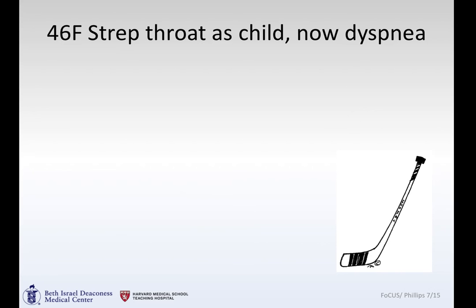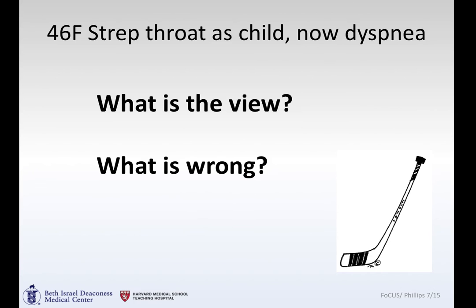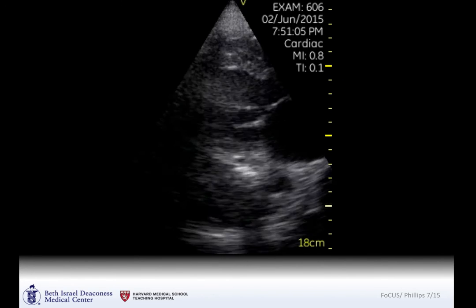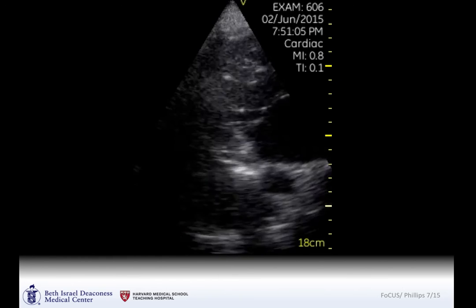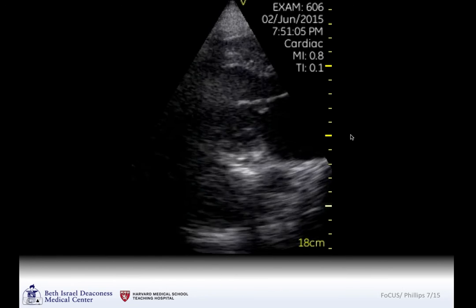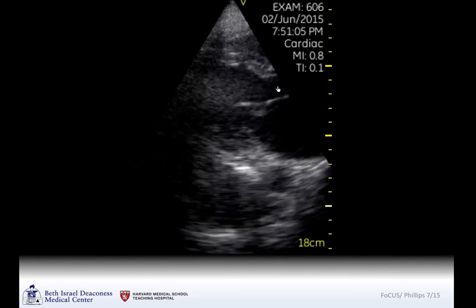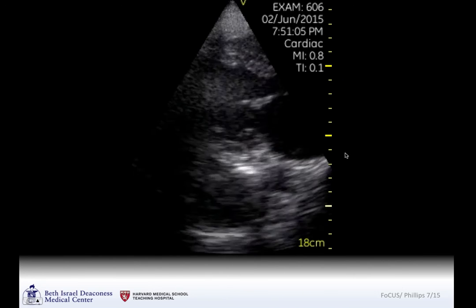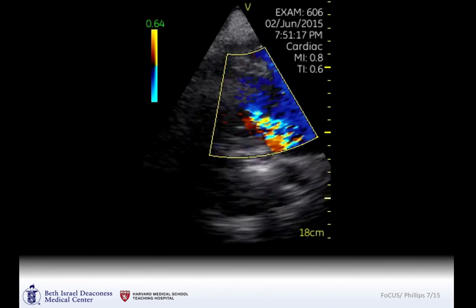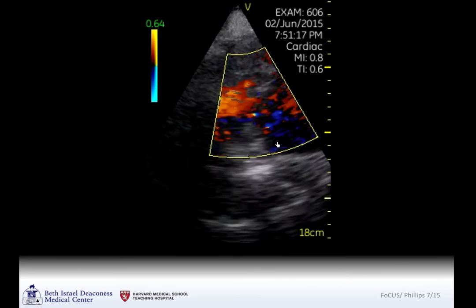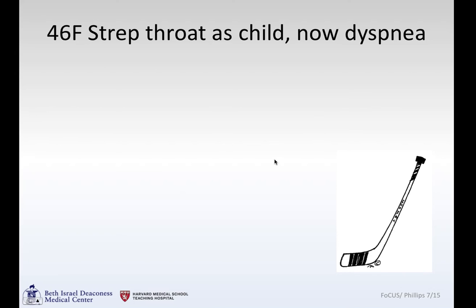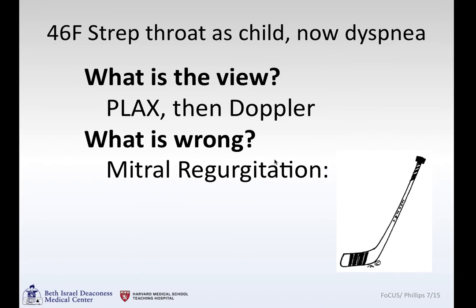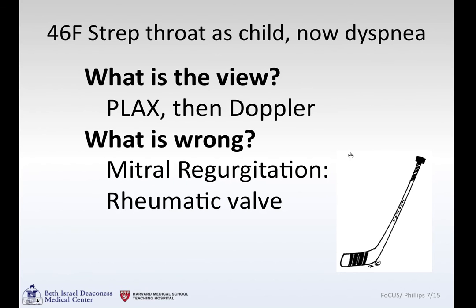A 46-year-old woman with a history of strep throat as a child now presenting with dyspnea. Parasternal long axis view: left atrium, left ventricle — the aortic valve is off the screen. Here's the mitral valve opening; the mitral valve doesn't look totally normal. With a little color Doppler added on top, during systole you can see a regurgitation jet back into the left atrium. Parasternal long axis with Doppler: mitral regurgitation. The mitral valve has a hockey-stick appearance, consistent with rheumatic changes — so rheumatic MR.